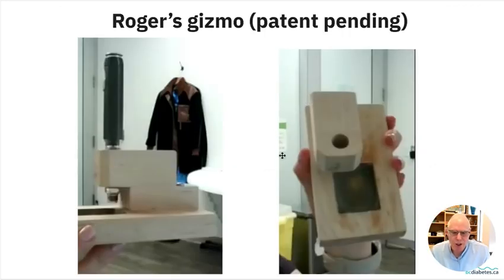Second amazing thing about Roger: how does a blind patient fill a pod? Filling pods is difficult for fully sighted people like me. He was a woodworker, and here he's designed a prototype to help him fill it. So he slips the pod under there, puts an insulin pen in, and fills it. He knows it's in the right position based on the feel of the black underlay. So he's going to get a patent on that. And he loves the voiceover feature of iPhone. It helps him read it, so he just touches the screen and it tells him everything he wants from each screen of Loop.